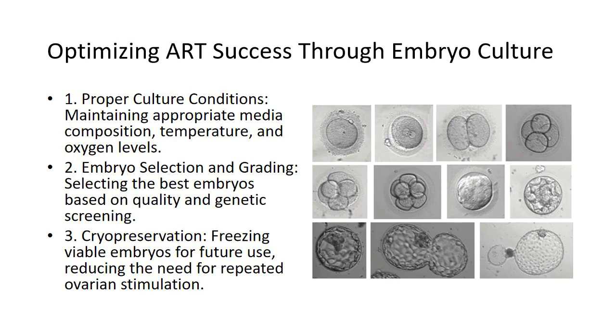Environmental control systems. The laboratory environment should be equipped with systems that monitor and regulate gas composition, e.g., oxygen and carbon dioxide levels, temperature, and pH to ensure consistent conditions during embryo development.